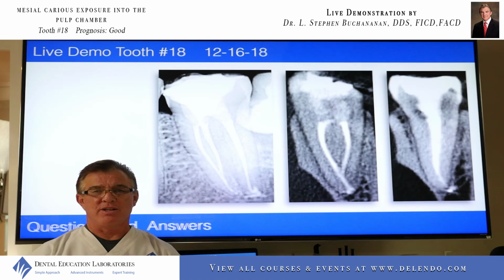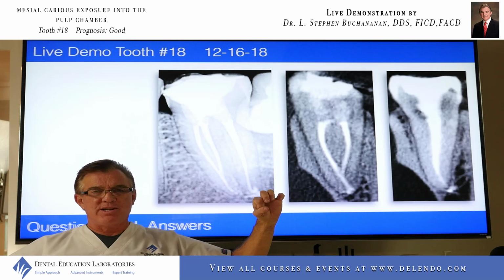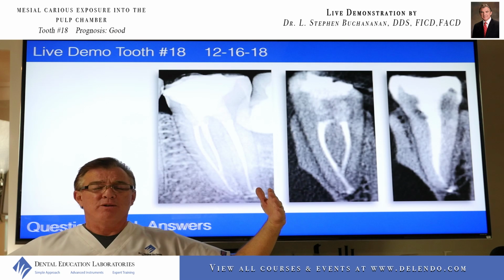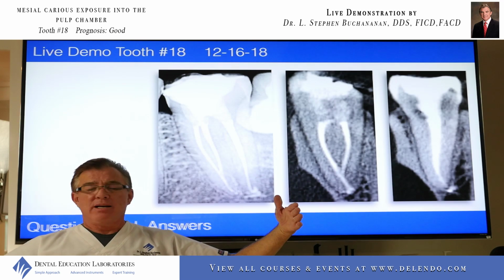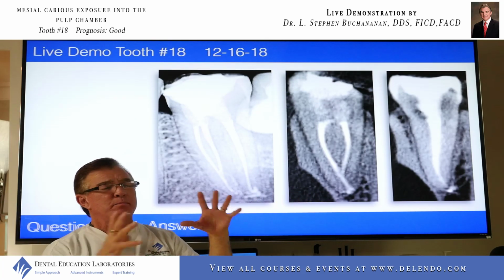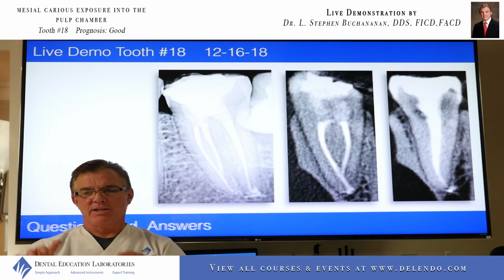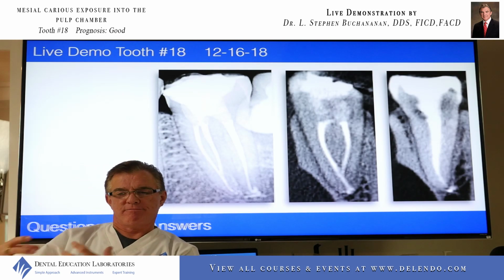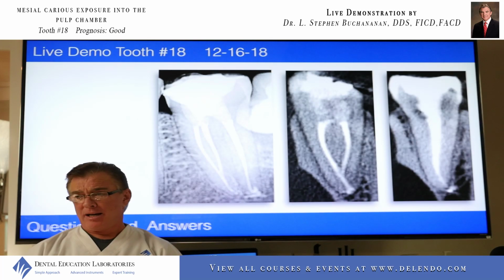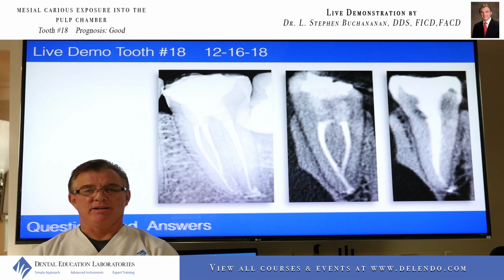Most dentists don't even know that 6 feet away from an old, crummy analog x-ray system that went for like half a second, that's as far as it goes. Six feet away from an old system was where the x-rays turned to heat. There's no more radiation out there. Now we have barely a 1 foot area around the Nomad. You can see there's a little bit of a ring around it that shields things from coming back on the operator's hand. But literally, I could aim it right at you, and if you're 2 feet away, it's going to have zero effect on you.